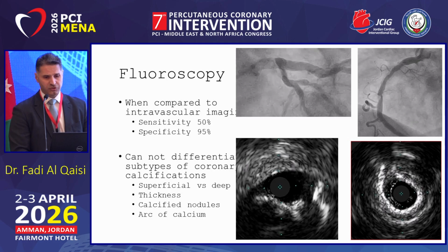On the other hand, you see this artery, and you say, okay, it's a small calcium, a small piece, I can crack it with the balloon. Let's try it. But when I did the IVUS, it could not cross the lesion. It was almost 360 degrees of calcium, very extensive, very harsh. I had to use Rota to clean the artery properly.